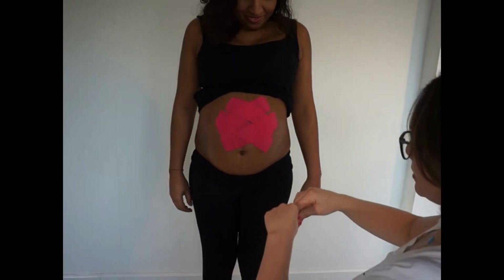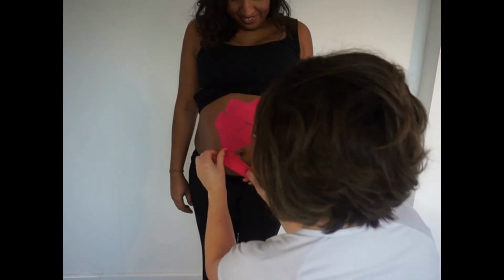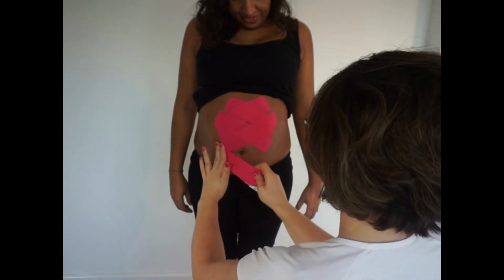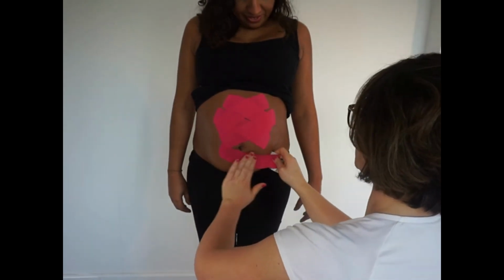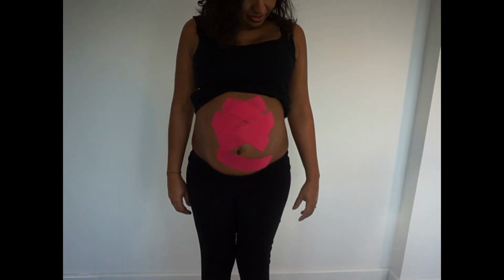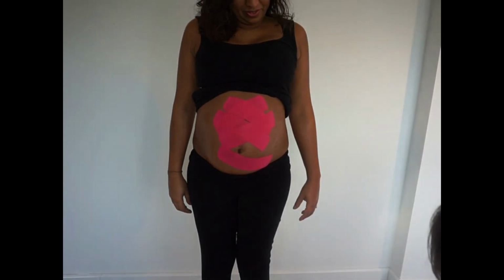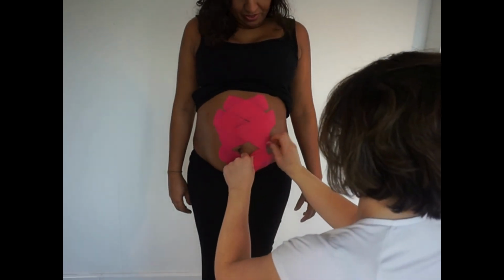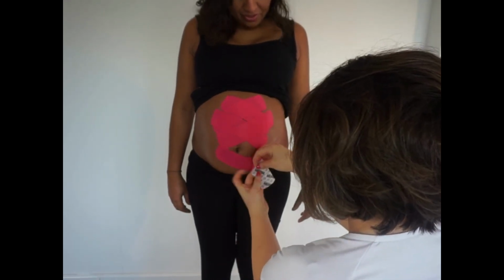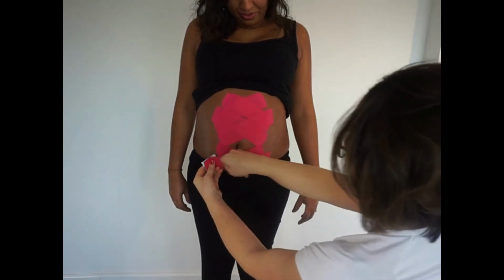Okay, and then we can also do this below the belly button. I tend to avoid the umbilicus because it can be uncomfortable, especially if the client's belly button is protruding. But again, be guided by your client. If that's where their gap is the widest or where they have the most discomfort, then applying a piece of tape with light pressure over that area might be completely indicated. So once again, anchor to one side, peel back the active portion of the tape, light to medium stretch, hug the baby, and closing to the other side.